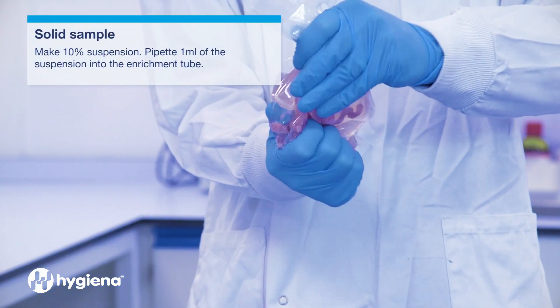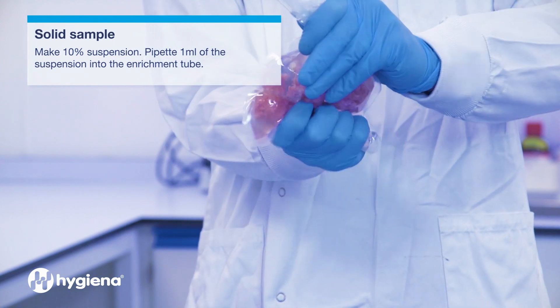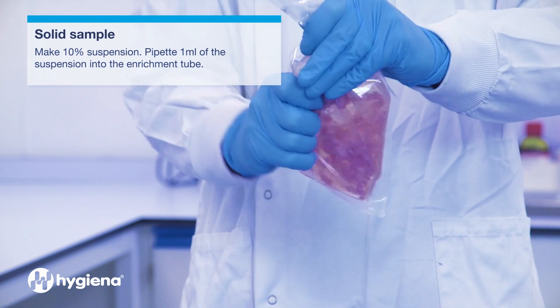For solid samples, make a 10% suspension and pipette 1 milliliter into the enrichment device.